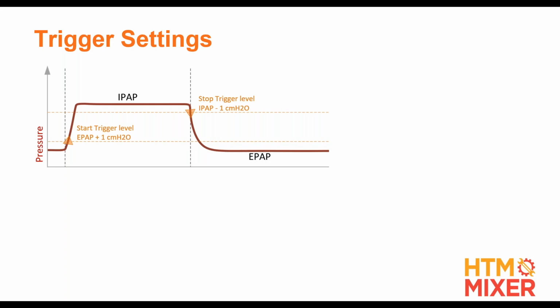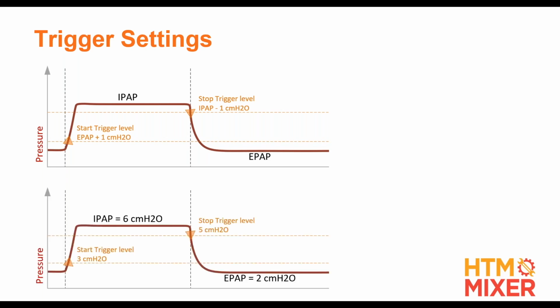So as soon as we go from EPAP to IPAP, we start to measure the inspiratory volume. And then as soon as we drop a little bit below IPAP, we set our trigger point there. Now we capture the inhalation phase, no problem. We can still tell what VTI is. We can never tell what VTE is because it just goes out to atmosphere. But in most cases, when you're testing a BiPAP ventilator, they won't ever ask because they know it's not coming back, right? Their ventilator isn't trying to measure exhaled tidal volumes like an ICU vent. So that works pretty well.